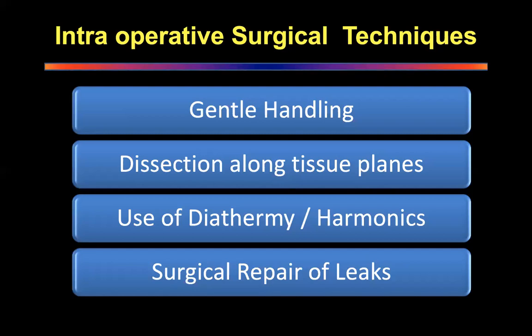If you see leaks on table, then it's always a good idea to repair the leak. Absolutely important. It's a good idea that you put in a couple of stitches on the table and try to stop the leak.